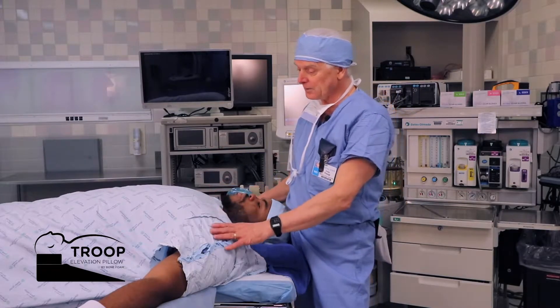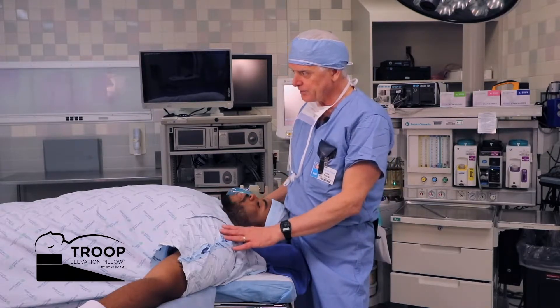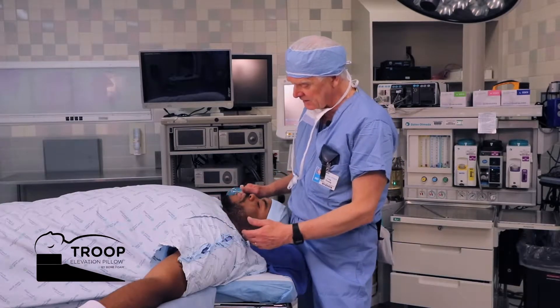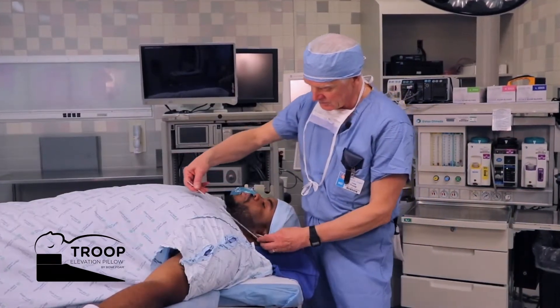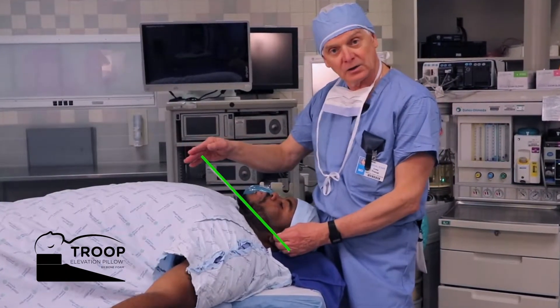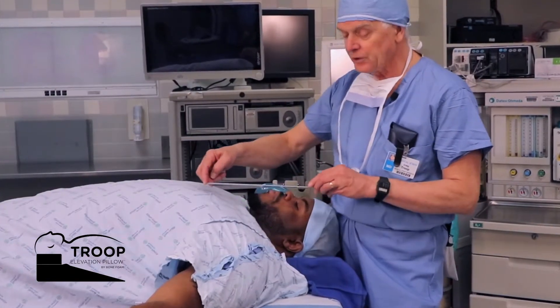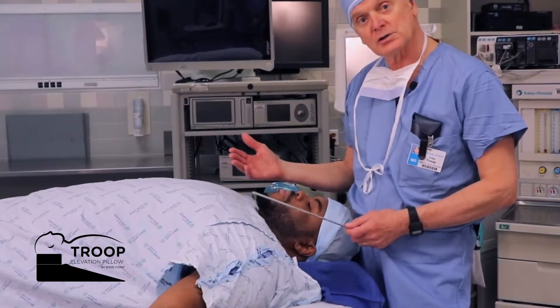Notice for our model patient here, Quinton, a larger man — 6'3", 6'4", a little over 300 pounds. Notice that the imaginary line from the ear, the external auditory meatus, to the suprasternal notch is an acute angle. If that imaginary line is more horizontal, the three airway axes will start to line up.